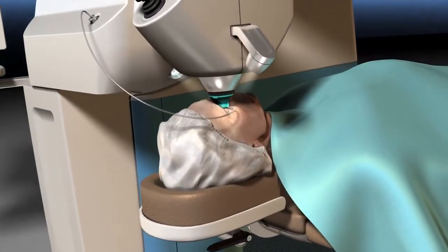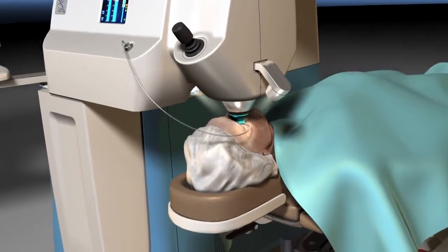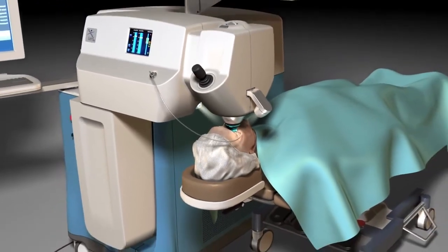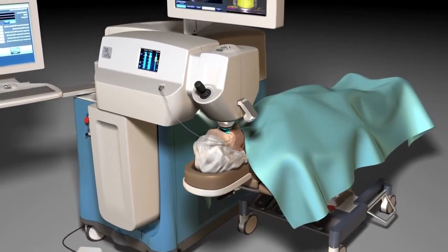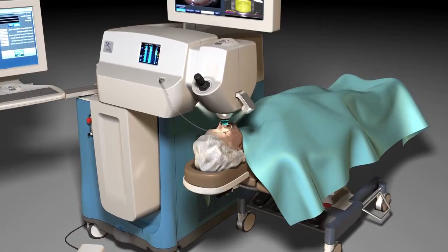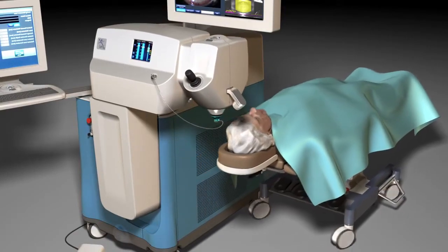Providing an overall faster surgical procedure, surgeons and patients now experience a reduction in laser time, a simple, easier docking process, a lower overall procedure time, and enhanced patient comfort.